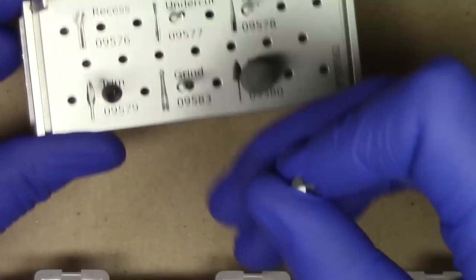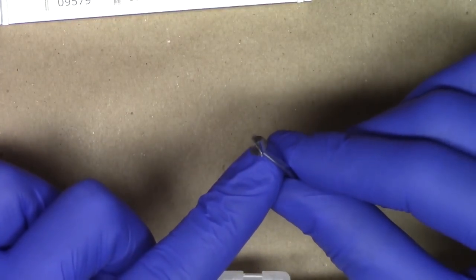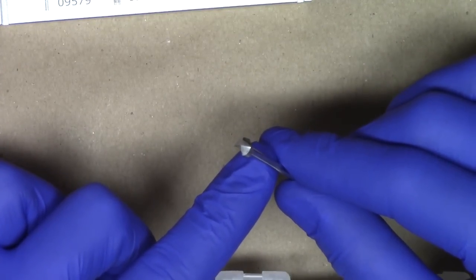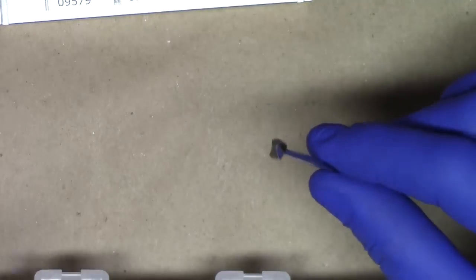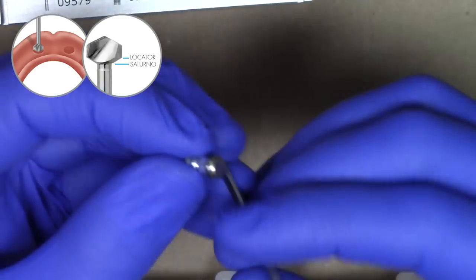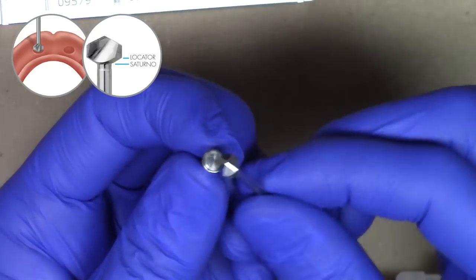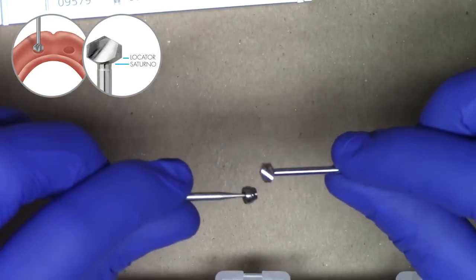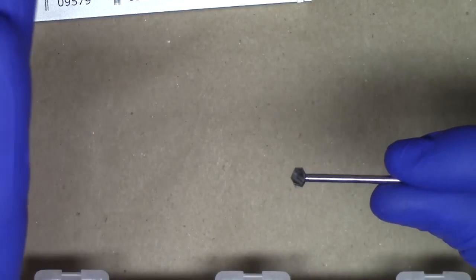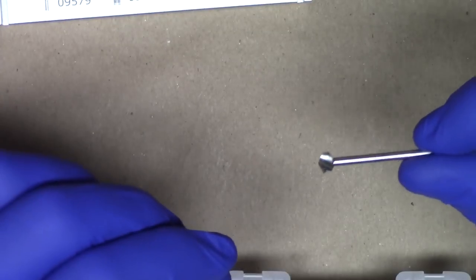This unique burr called the Chairside Recess Burr is the first thing that should grab your eye. This burr is specifically designed by Zest Anchors so that you can quickly and easily prepare the exact size recess for the locator and Saturno denture caps. As you see here, pulling out a locator denture cap on this analog, it is perfectly sized so that you can very easily insert that recess burr into the complete denture, preparing a hole that matches either that or the Saturno denture cap. It's really uniquely designed so you don't have to do any complex motions — just insert vertically and pull out vertically in a very straightforward gentle motion.